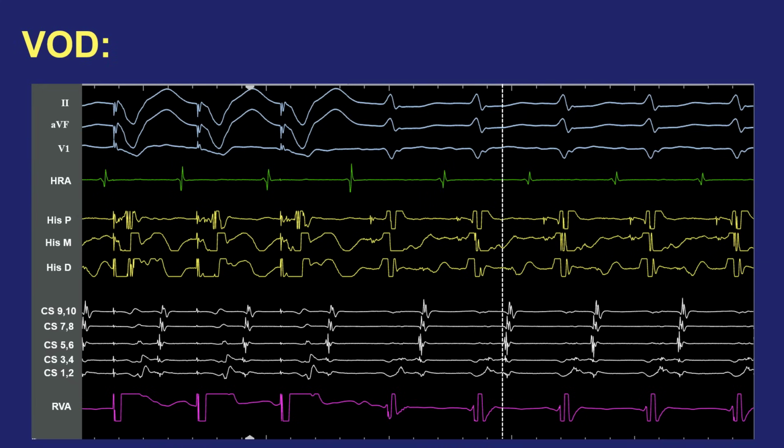from the three mechanisms. The earliest atrial activation looks like it's CS56. You know, that's a little bit eccentric, but it depends on where your coronary sinus catheter is positioned. And is it possible to have a left inferior extension of the AV node that extends out this far to activate the atrium at the CS56 location? Yeah, it's possible. So I wouldn't fully cross off the list AV node reentry from the activation sequence. What about the VA time? It's 140 milliseconds.